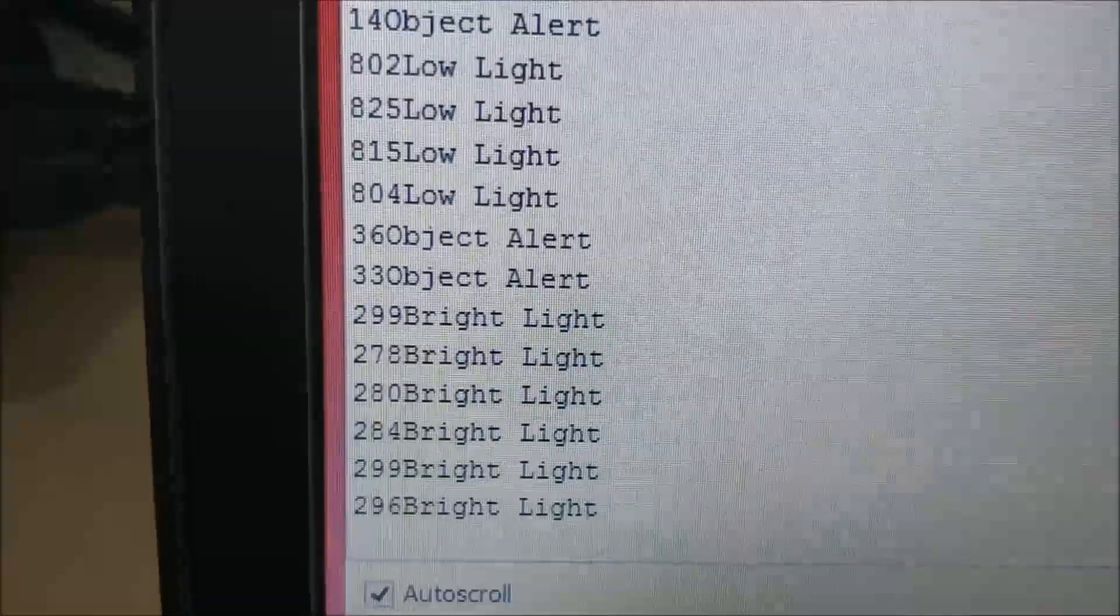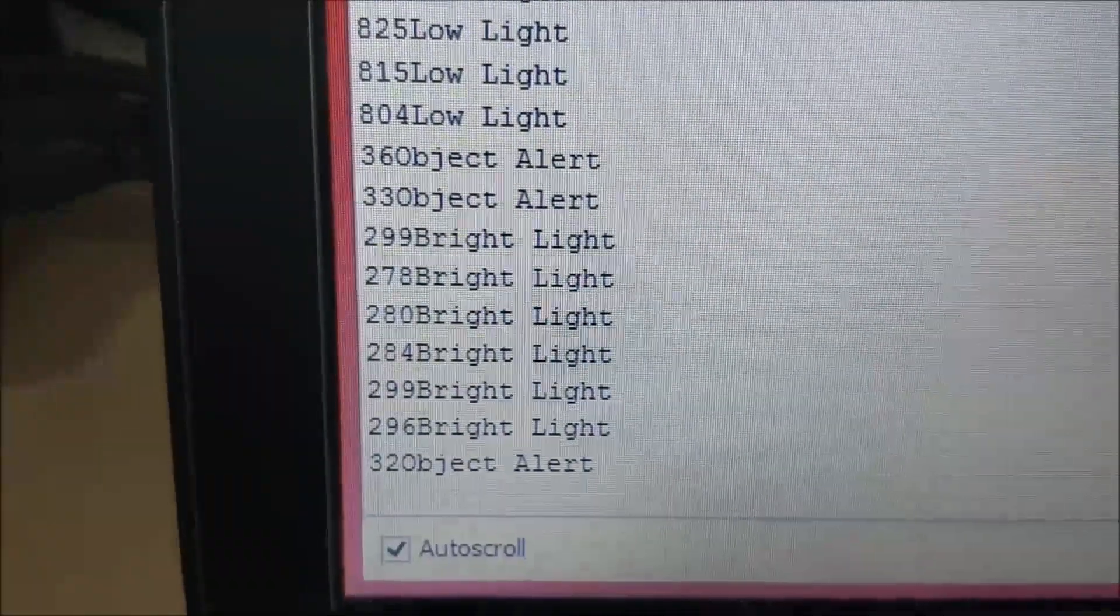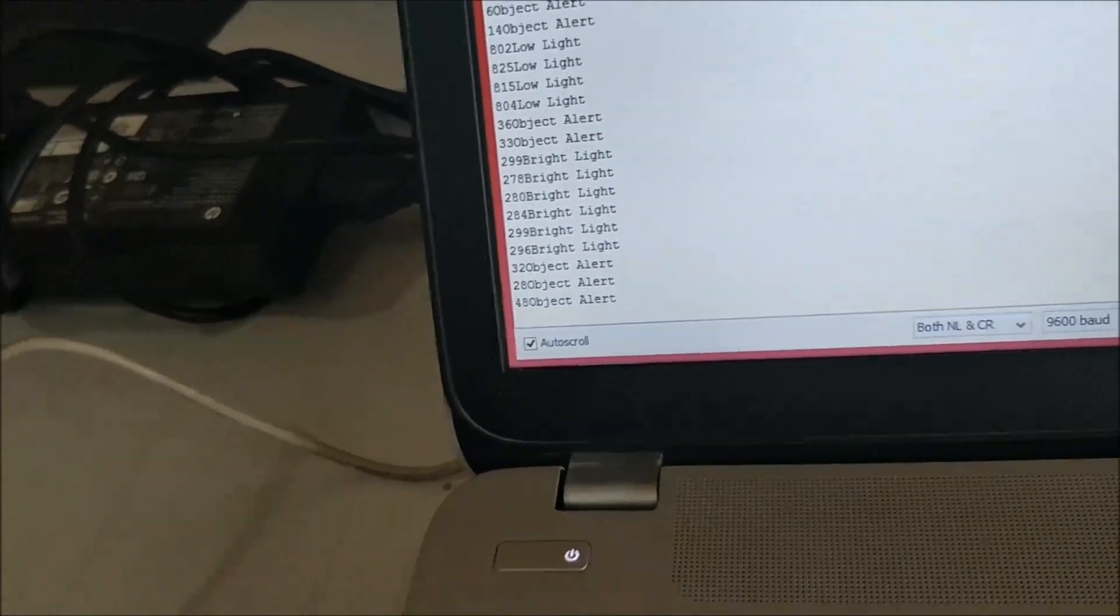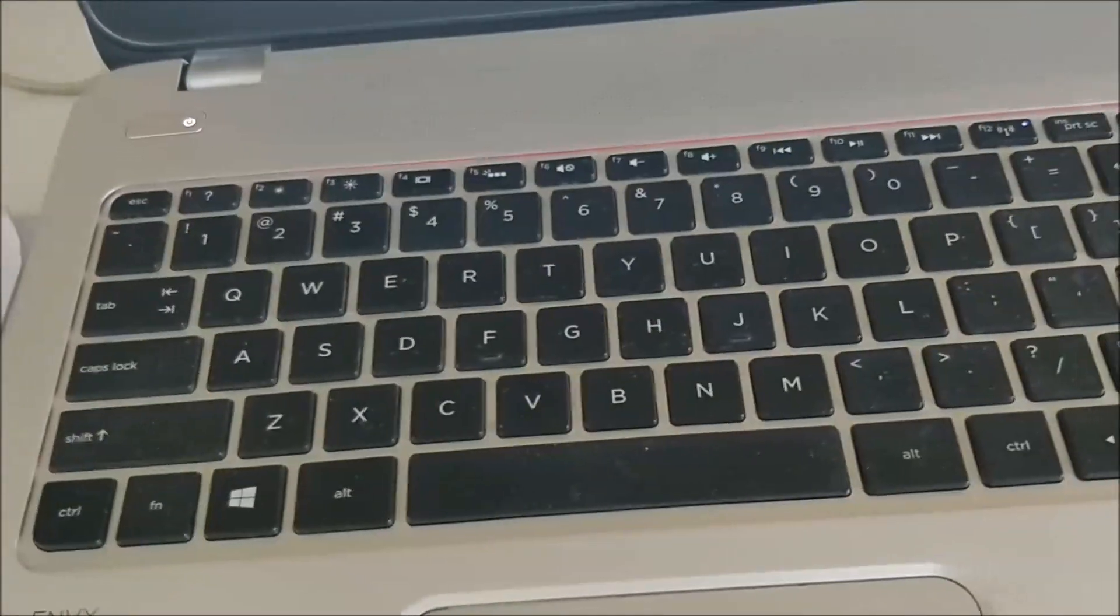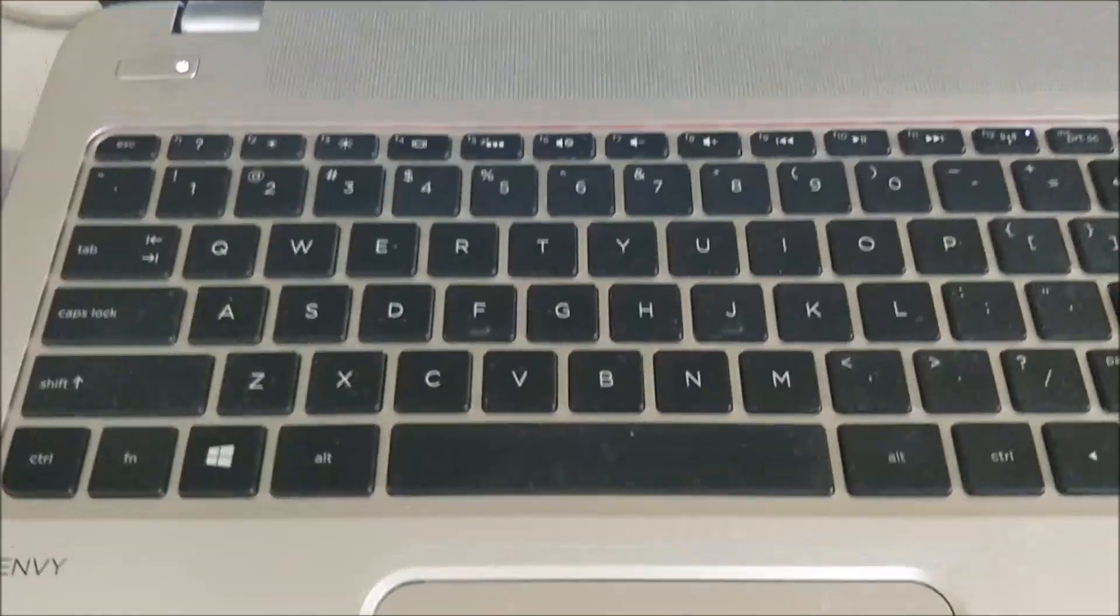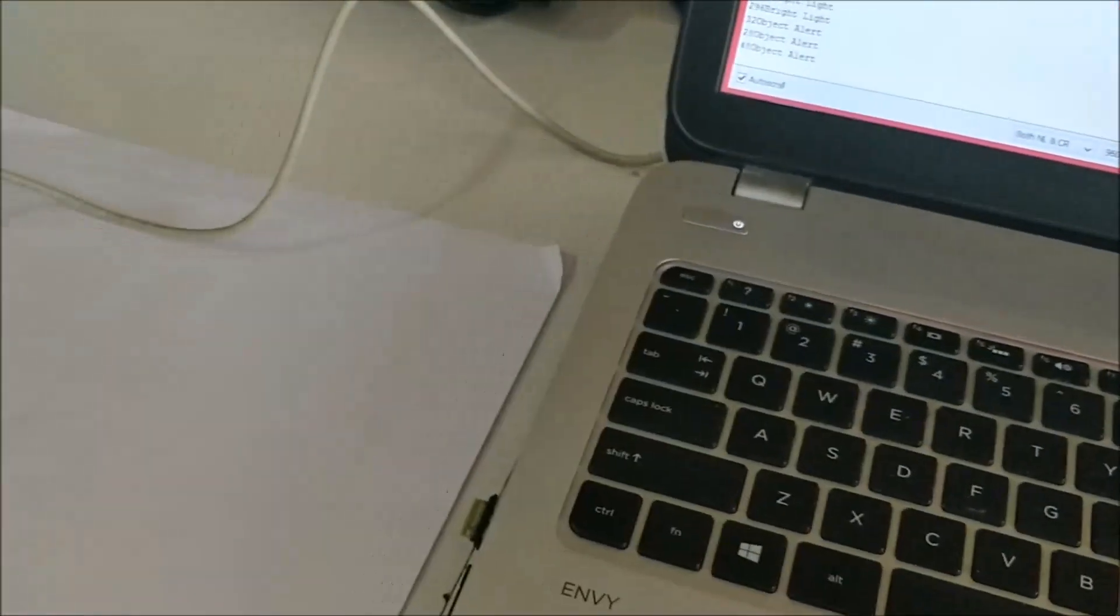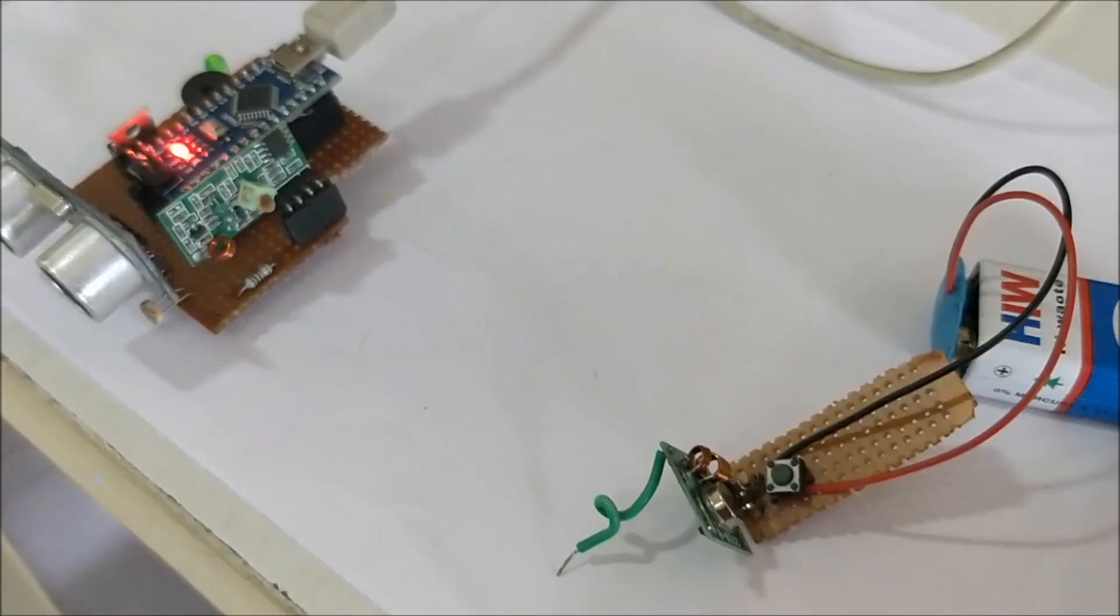As you can see, the serial monitor says it's bright light and you can hear this tone. The blind man can identify if he is in a dark room or bright room. Of course, you can program it to modify the intensity threshold and change the beep sound. Now let's see how the remote control works.